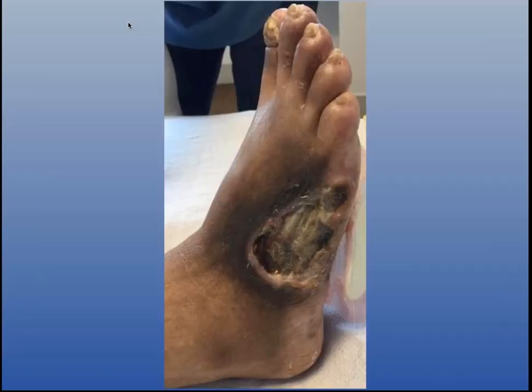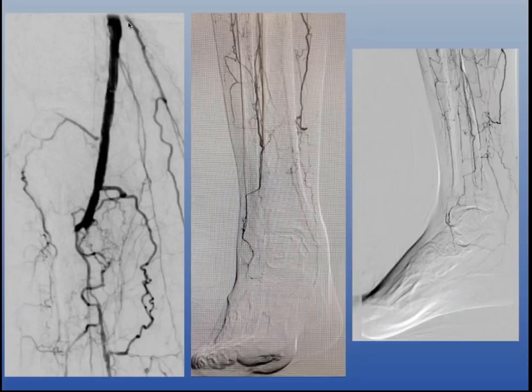So here's another case which shows two strategies to the same problem. So now we have a CLI patient who you can tell has really chronic ischemic changes. They've got shiny hairless skin, they've got thickened nails, they've got this huge wound which is down to the tendons. This patient really is at risk for a major amputation, and so we have to really figure out what we can do. Here's what the initial angiogram looked like.